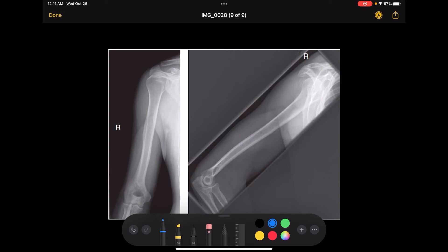For the lateral view of the humerus, all you need to do is position the arm so that there is a 90-degree angle at the elbow. You can tell if it is rotated correctly if the lesser tubercle is on the inner, medial side, and the greater tubercle should be superimposed over the humeral head.